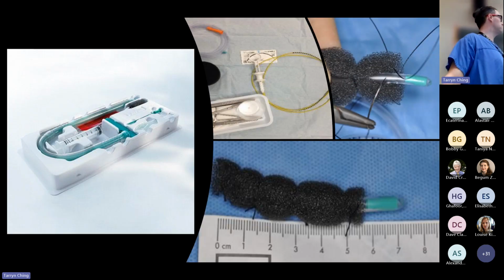There are 2 rough ways of making do. There's a device called an Eso-Sponge. And if I flip between talking about Eso-Sponge and Endovac today, it's just 2 different devices; it's the same thing. Or there is a means for making one with an NG tube, some black foam and some stitches. They both have pros and cons in how those devices are put together. I'm not going to labour the point today, but they both have their role.